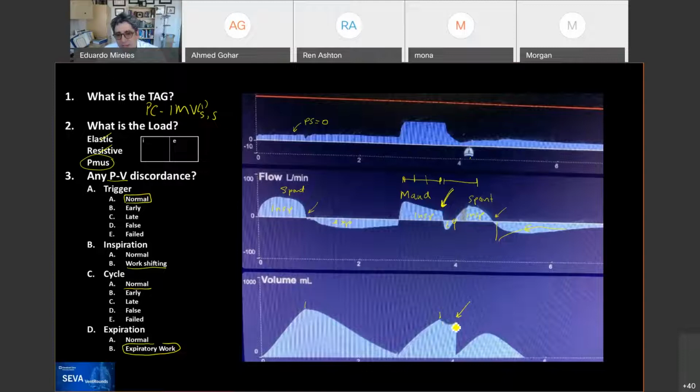So what you're seeing here is that the patient was exhaling, and then started doing effort and crossed the 0 line, and boom, it went through, which goes towards what Ariel is thinking, that maybe this is the release volume of the circuit, although it seems pretty large, it's hard to know. I mean, it's a liter here, so I don't know how much that was. The total tidal volume of a breath on the right seems to be close to a liter, which could be a lot. That's one of the problems whenever the patient determines the tidal volume, right? They can have as much tidal volume as they wish.